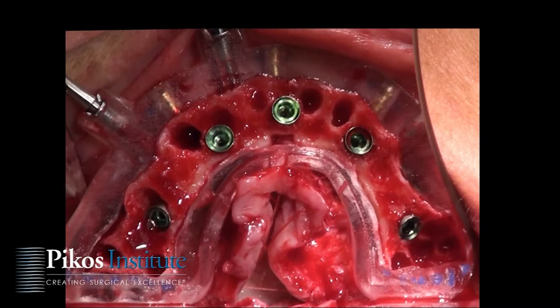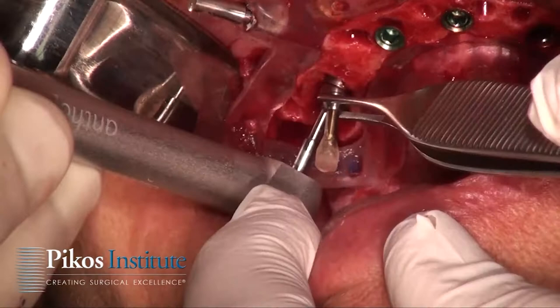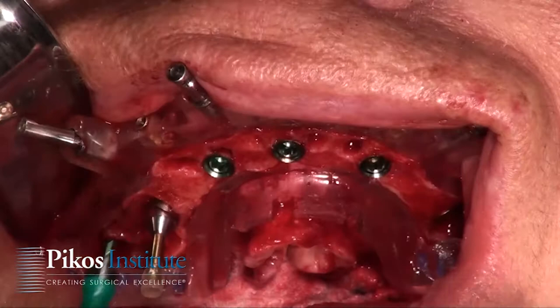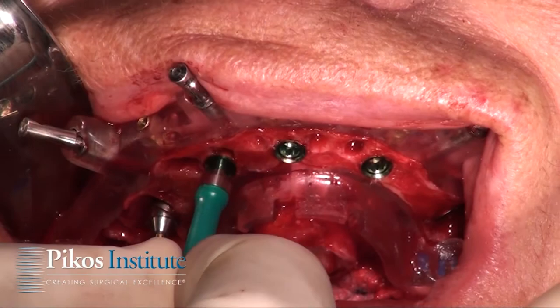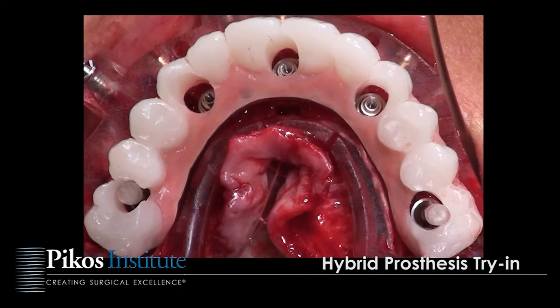It's a very comprehensive course, as is true for the entire course spectrum within our continuum from single tooth to full arch reconstruction at the Institute. This particular course addresses full arch and full mouth only. Within our three-day course we cover typical lecture and discussion material, followed by a tremendous hands-on component that allows you to appreciate and work through the step-by-step protocol.